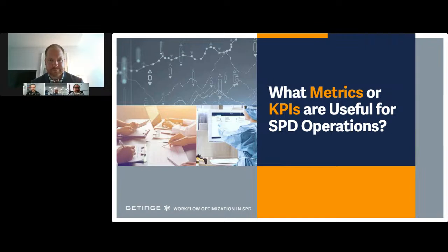So you need to select some sort of device. There's multitudes of things, whether it's protein test, resi test, ATP, whatever your preference of choice is. You want to be able to make sure that you are actually verifying that your processes are truly working. And that's just an example for decon. That's pretty much at every stage of the game.